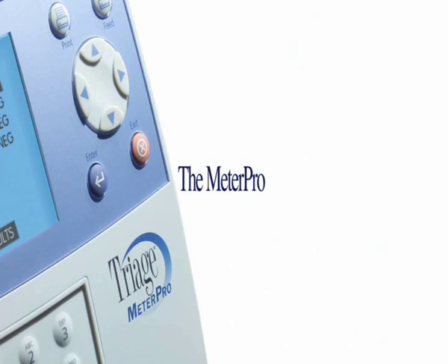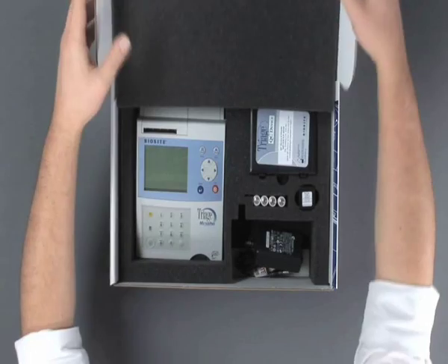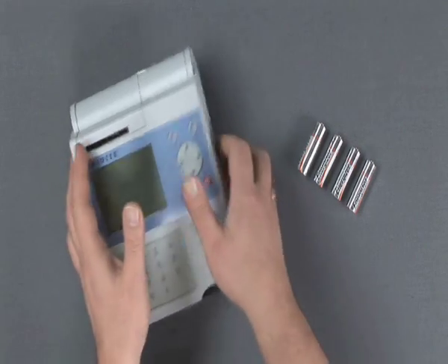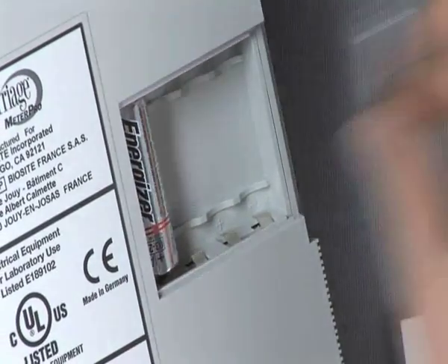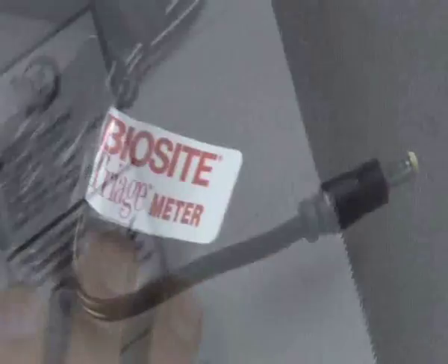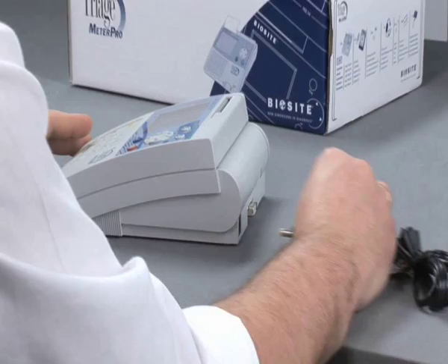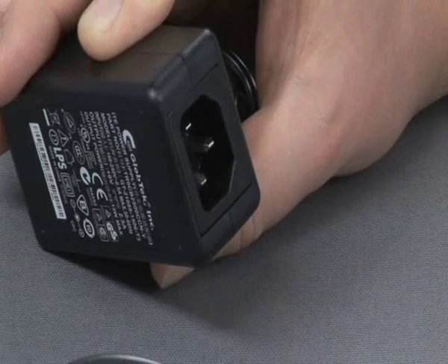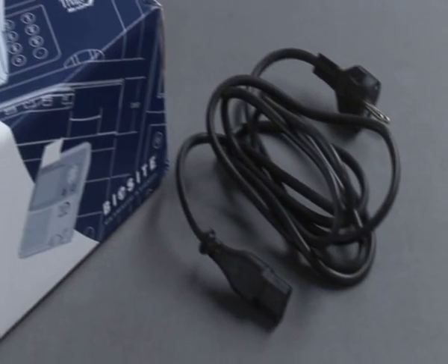The MeterPro. The MeterPro box contains a number of materials. 4 AA batteries. Remove the cover at the bottom of the meter to insert the batteries. Don't do this if the meter will always be plugged into the wall. Power supply adapter. Be careful. The extension from the adapter to the wall is tailor-made to the different country specifications and is delivered outside the box.